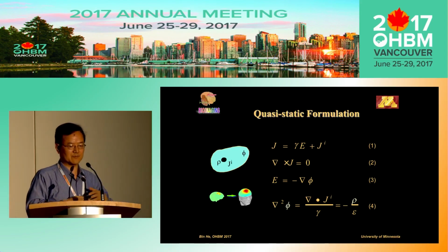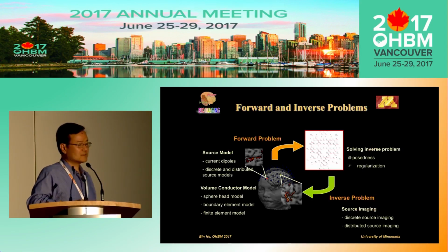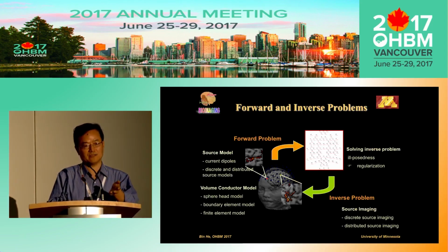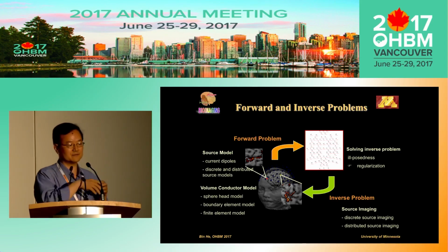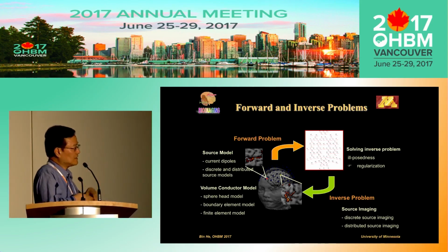But of course, the beauty is we have all these inverse solutions that we could restore the lost information. This slide just illustrates what kind of technical challenges you face if you want to get into this field, or you already are in this field or want to do more. You can see that we talk about source modeling and volume conductor modeling, and then there's another challenge: you need to solve the inverse problem, and this problem can be solved.